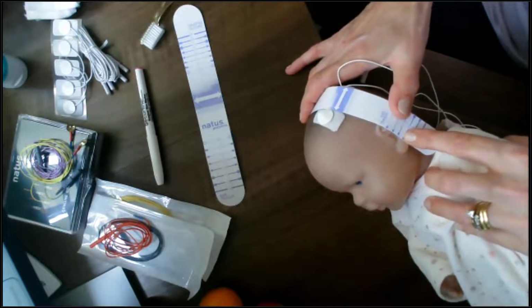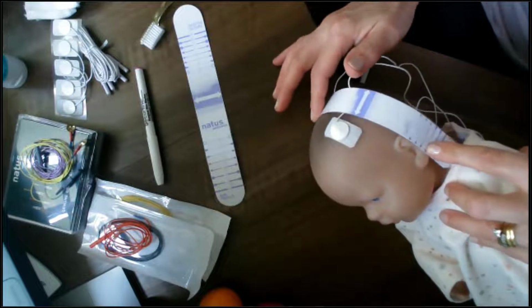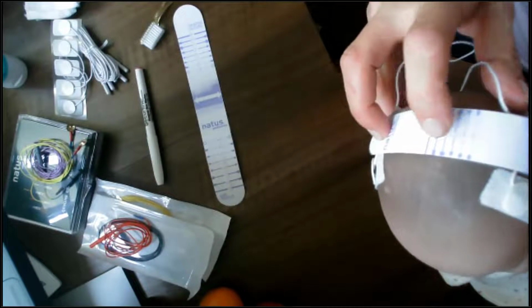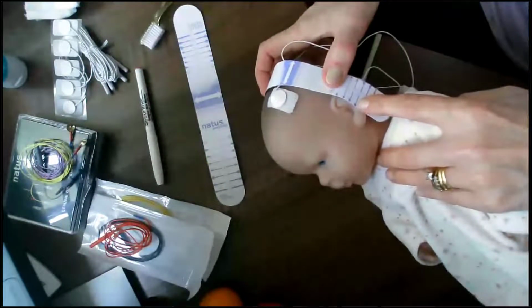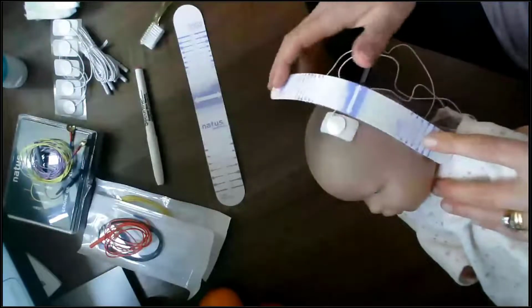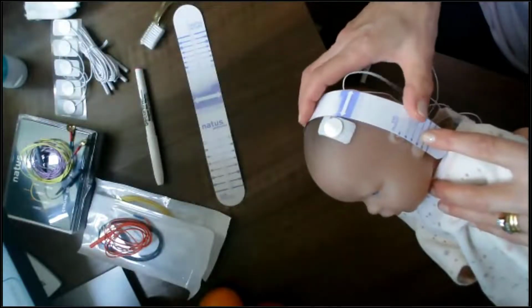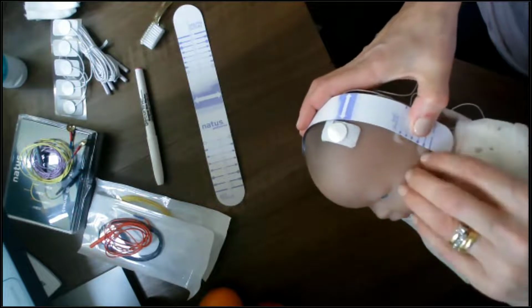And what I want to do here is slide this backwards and forwards until the same letter of the alphabet sits at the sagittal suture and the ear tragus. Now, I know from experience that on this baby, that happens to be the letter D because I've measured her a fair few times.